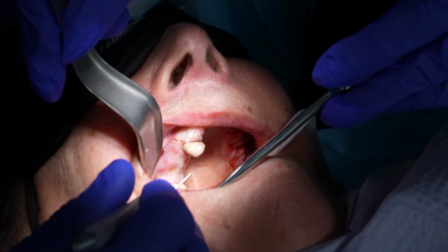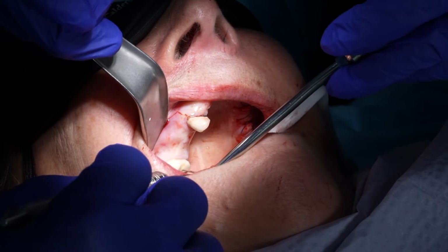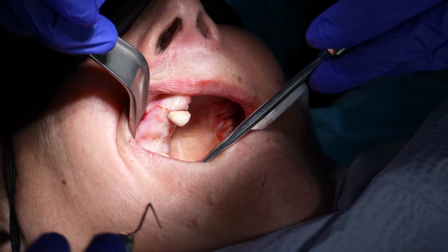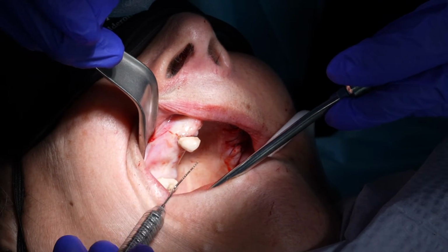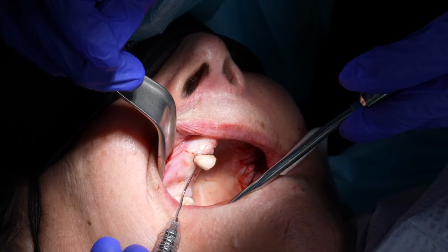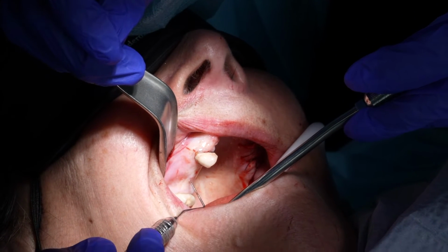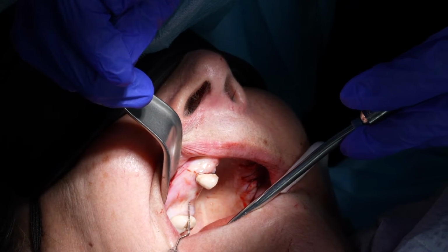This is a classic case over here where we have the distance between a premolar here, I'm sorry, canine here and a molar. How do we measure the distance from here to here? So we can turn around and try to use a probe, but the probe has a limited distance. So I can measure 10 and guesstimate here about 16 millimeters.